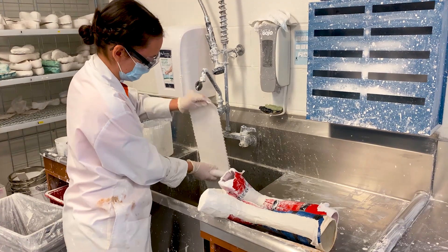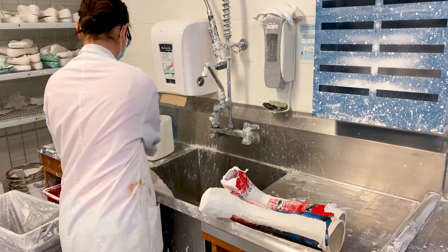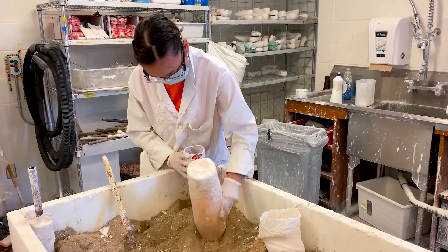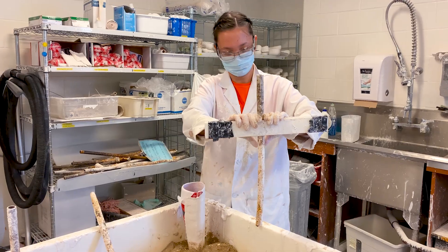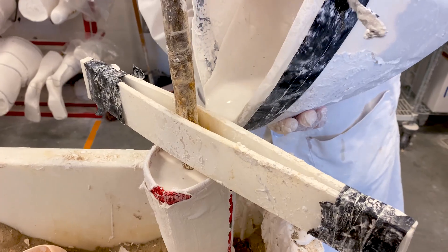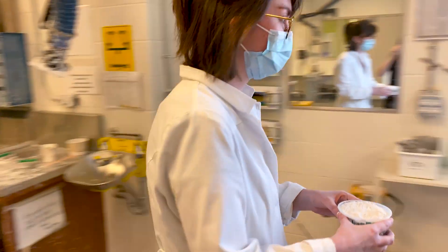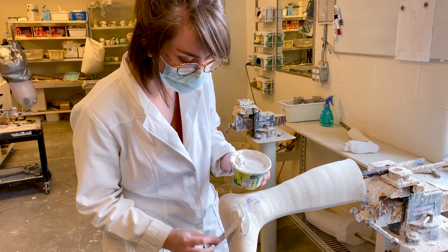The turnaround time for one of these ankle-foot orthoses is about three weeks, but it really depends on how many projects are going on in the workshop at one time. We'll show you different orthoses at different stages of development. The cast Wendy made of the patient's foot and ankle is called a negative cast. Orthotic technicians like Emma will first seal it, set it up in the sandbox to prevent tipping, and fill it with plaster to create a positive cast — basically a model of the patient's leg.